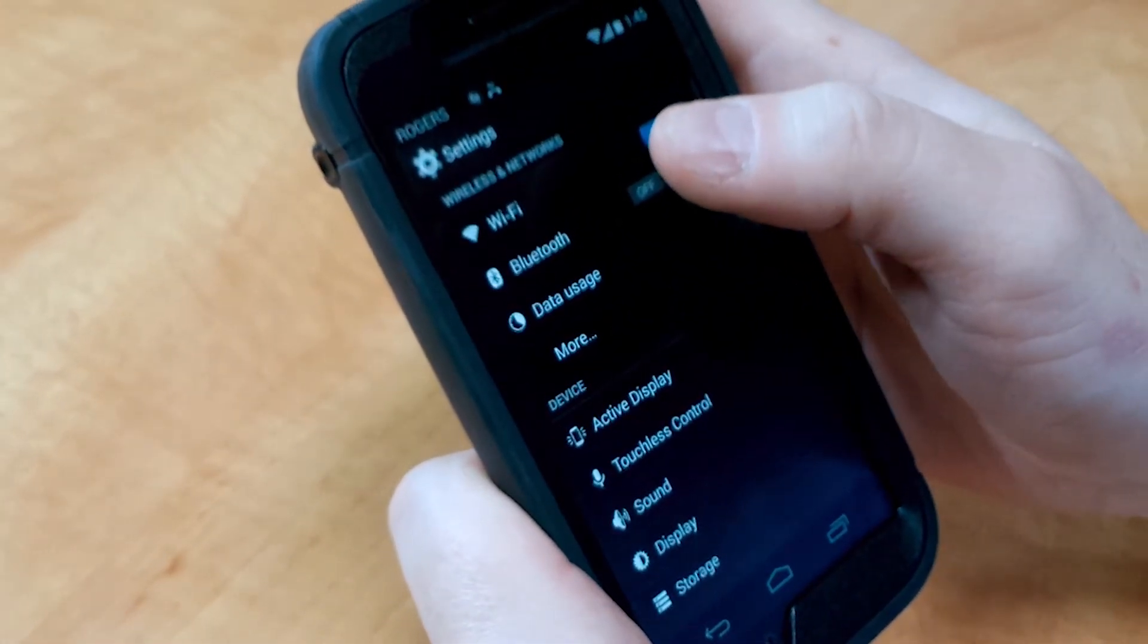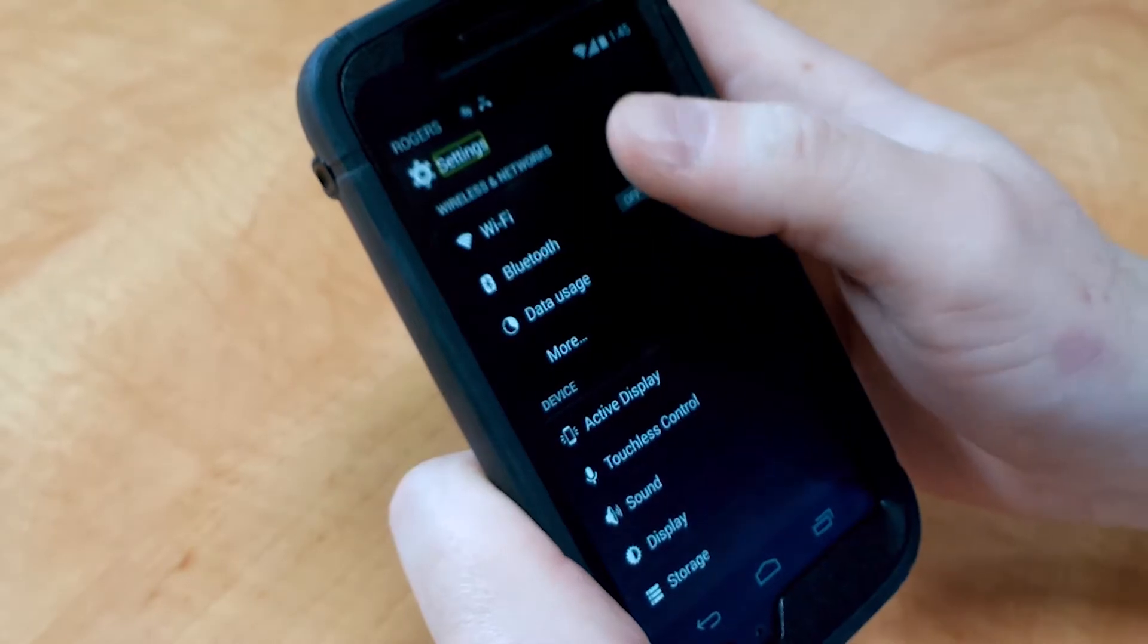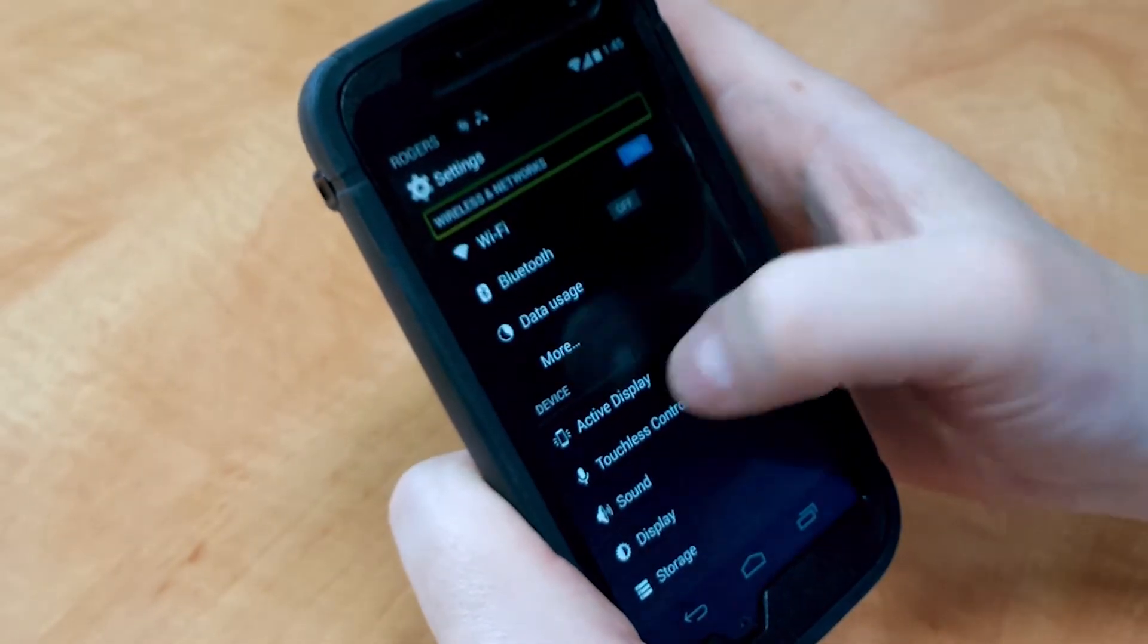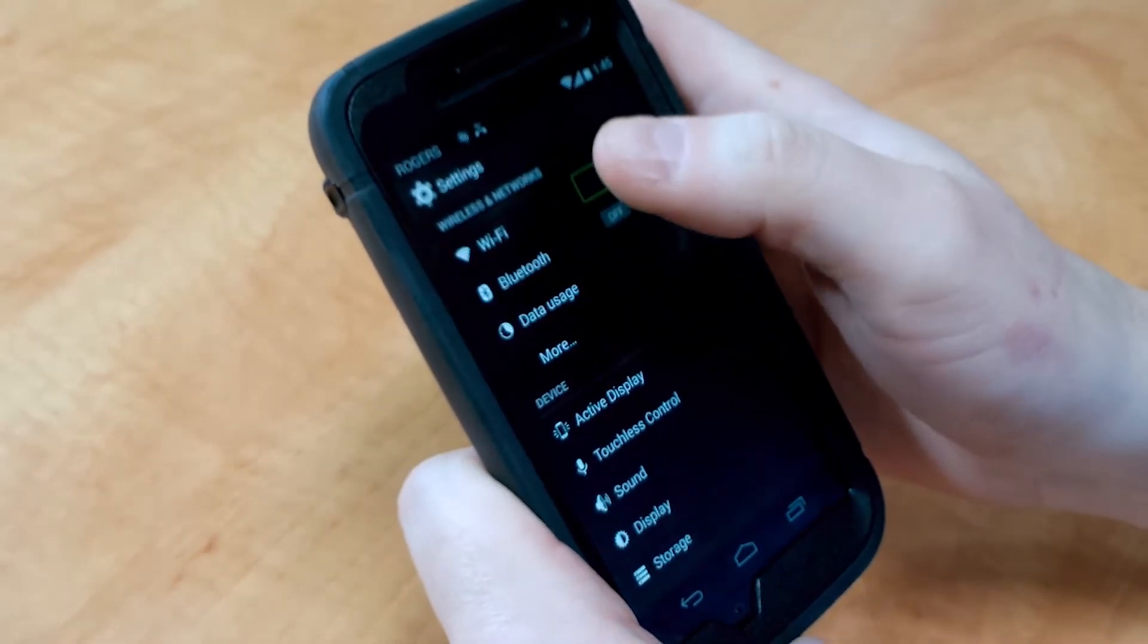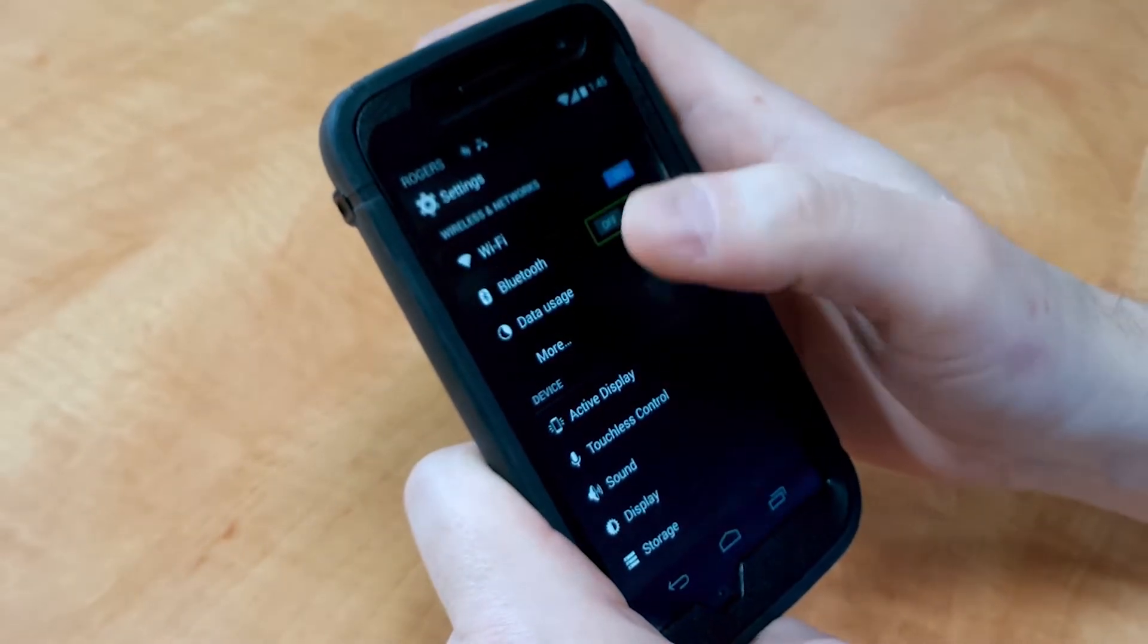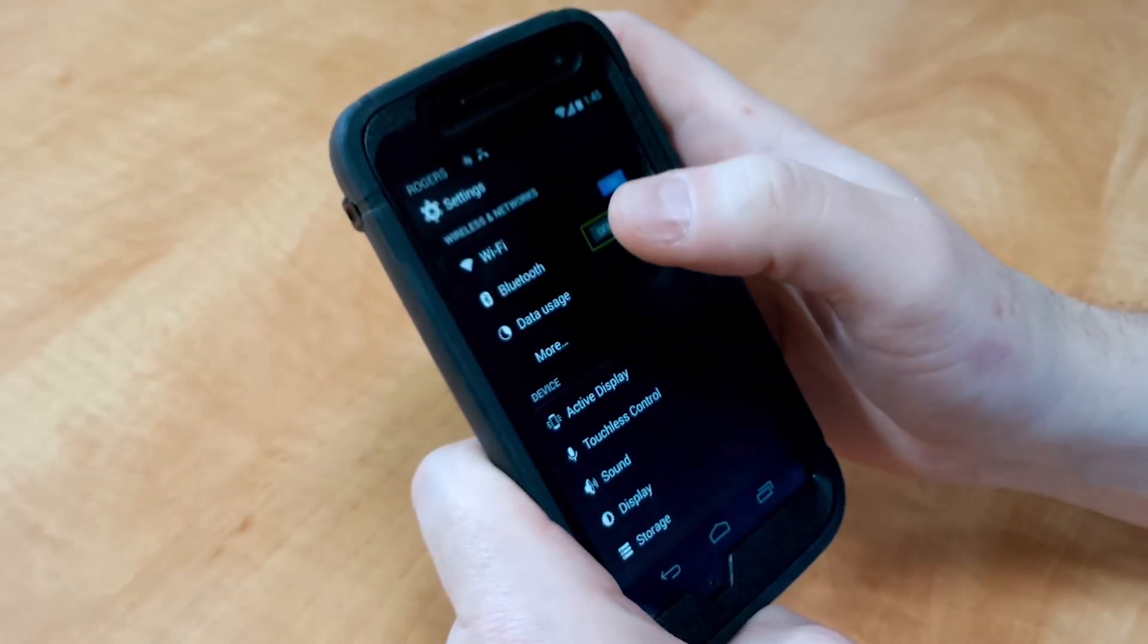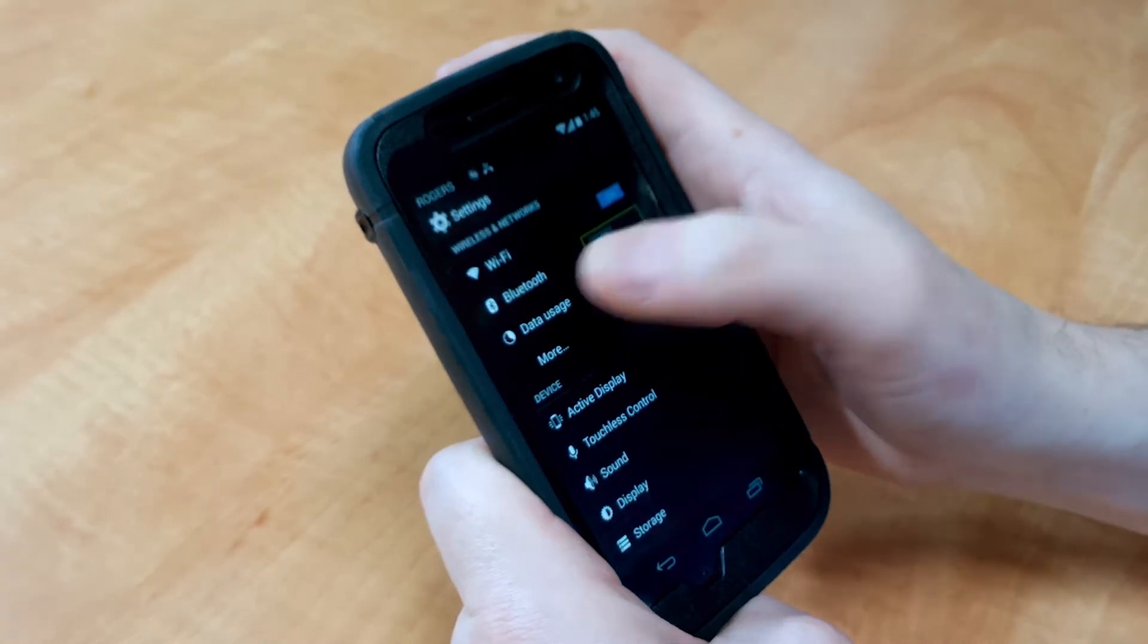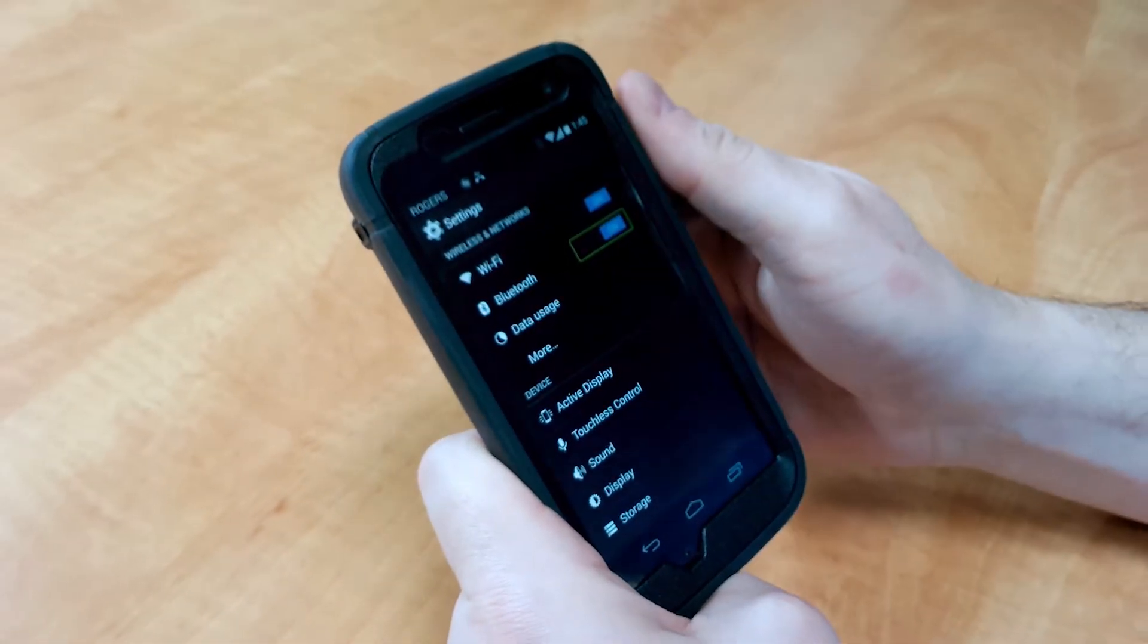Swipe down until you get to the Bluetooth section. There's Bluetooth and it tells me that it's off so I'm going to double tap to turn that on. Bluetooth is now on.